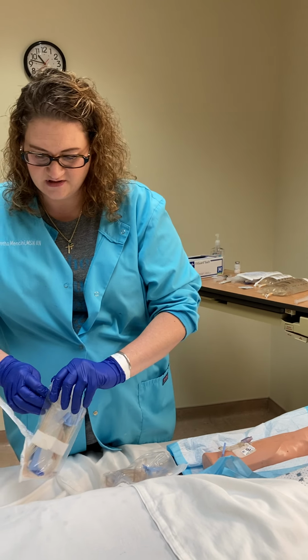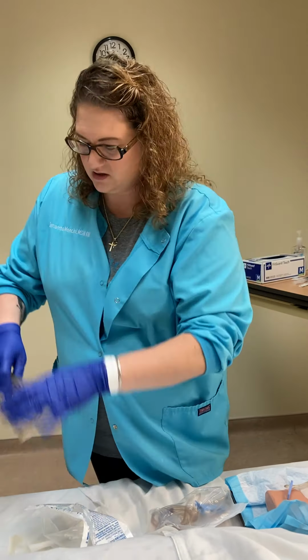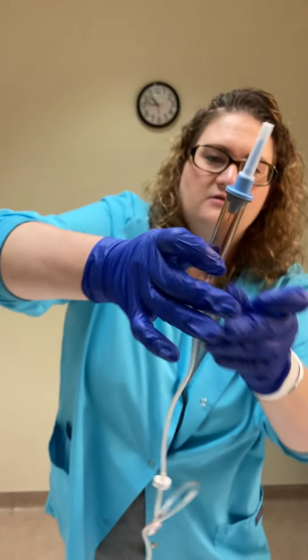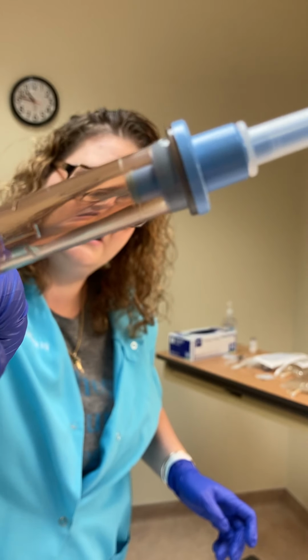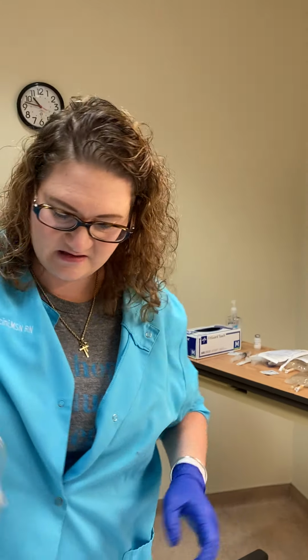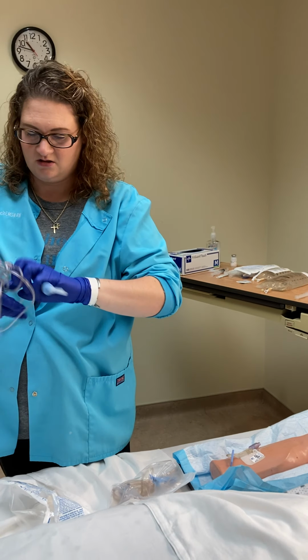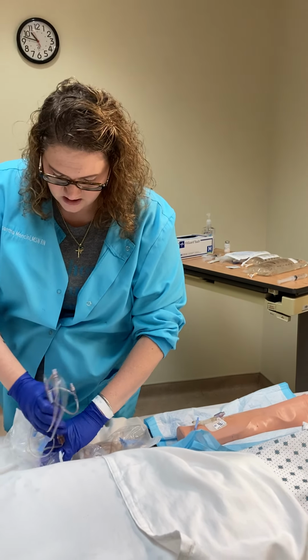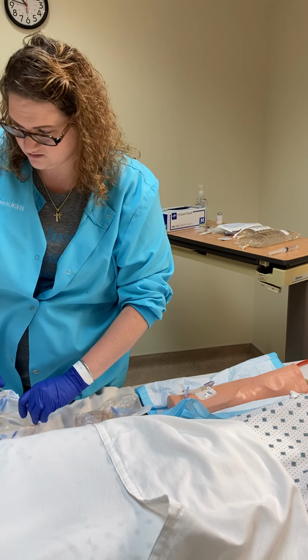Another way to tell the difference, usually with the micro tubing, I don't know if you can see, but it looks like there's a little spike there in the middle. That's what the micro tubing has. The macro tubing doesn't have that. Your totes come with the macro tubing, so that's what I'm going to demo.